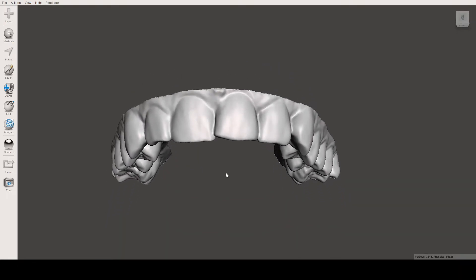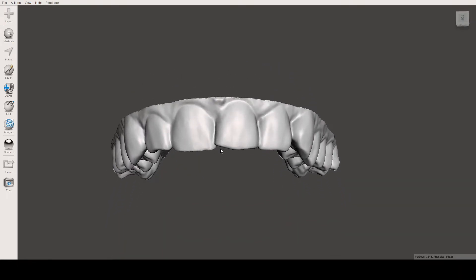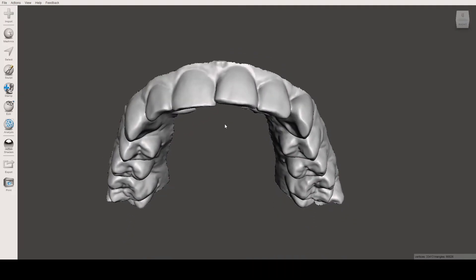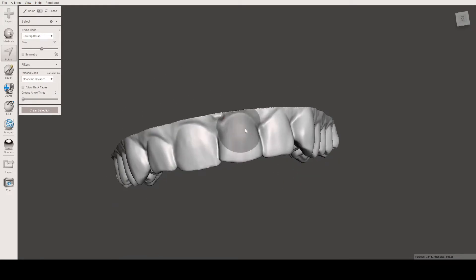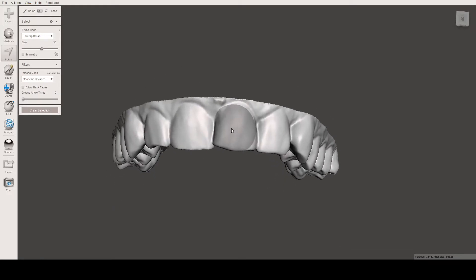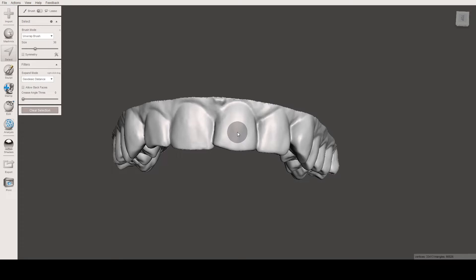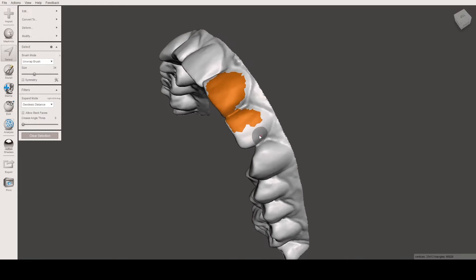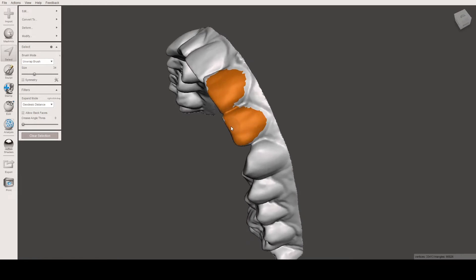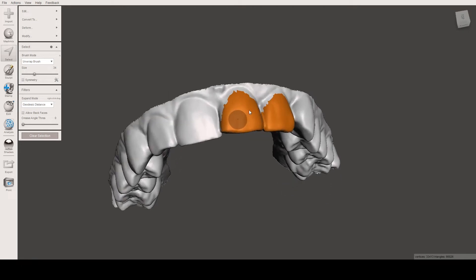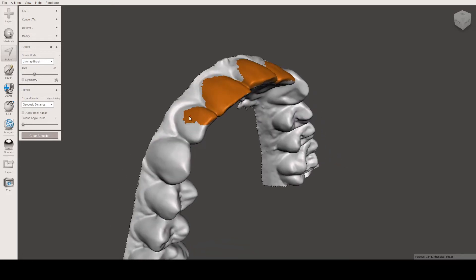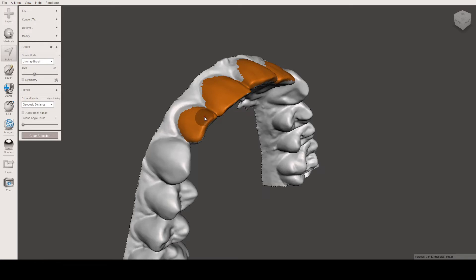The first thing we want to do is select the area where we want to create the shell. To select an area, we press S and we get this circle or brush. We can decrease or increase its size using the square bracket keys on the keyboard, and we just paint or highlight the area. We can rotate the model using right-click and select using left-click. We will create a shell around these four incisors.